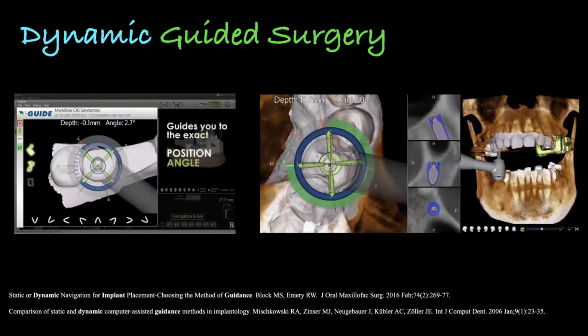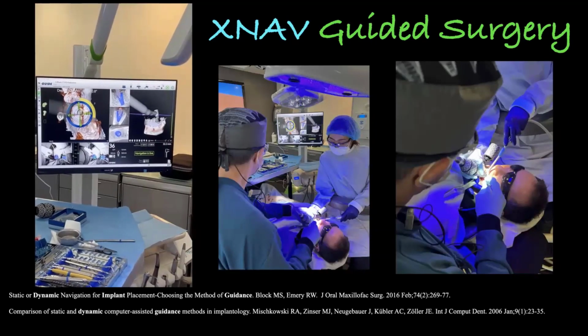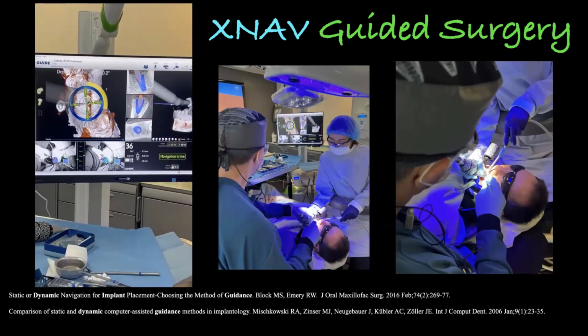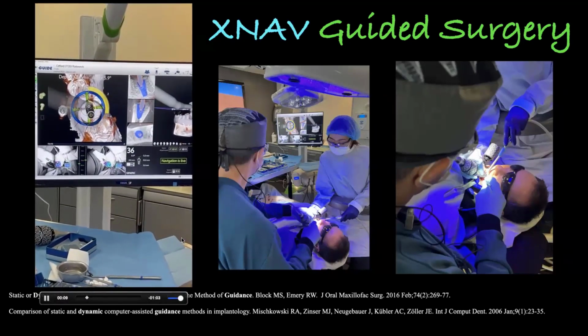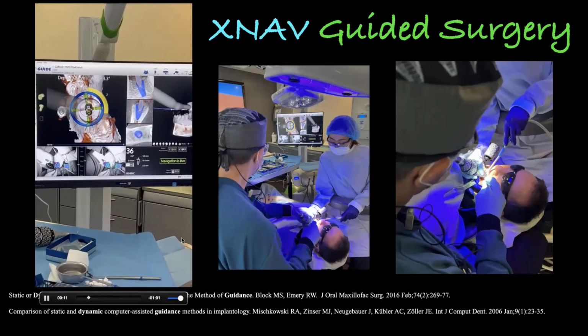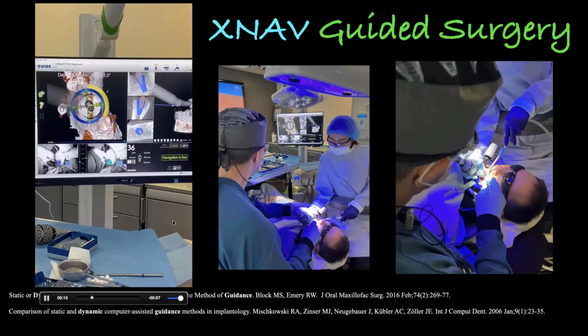And so when it comes to dynamic guided surgery, the beauty of it is that it's instantaneous. If you look at a case like this, we have a surgery that's being done live, where we're able to really utilize where the drilling is going to be, and where we're drilling to be able to create an osteotomy. And you can see it with the screen in real time.